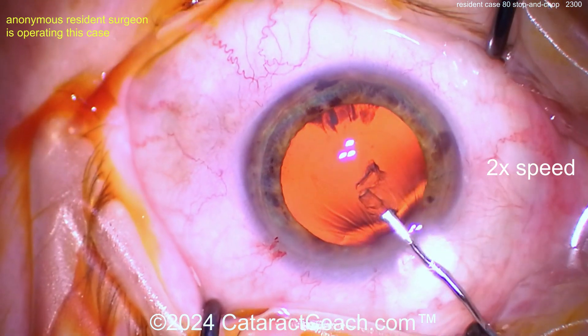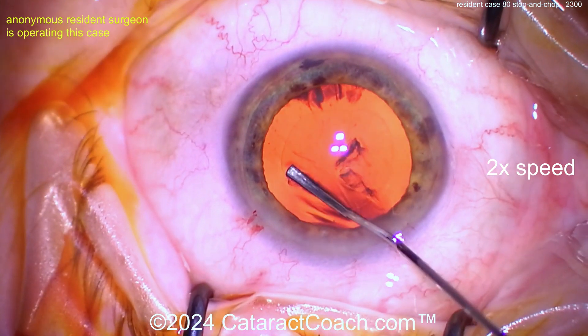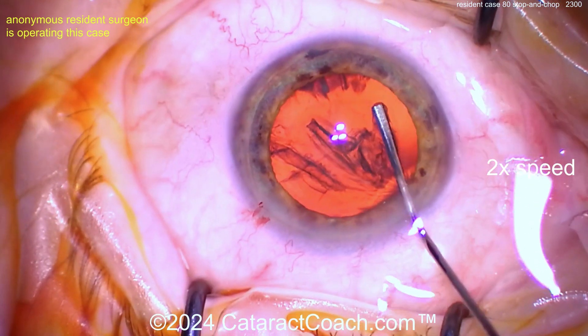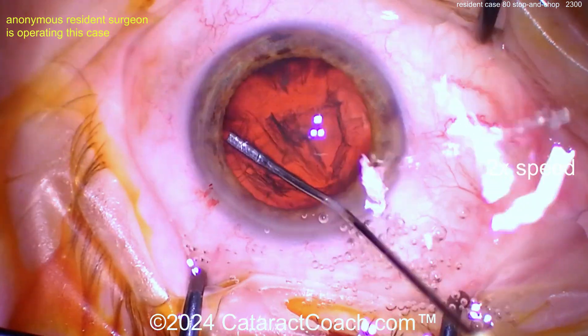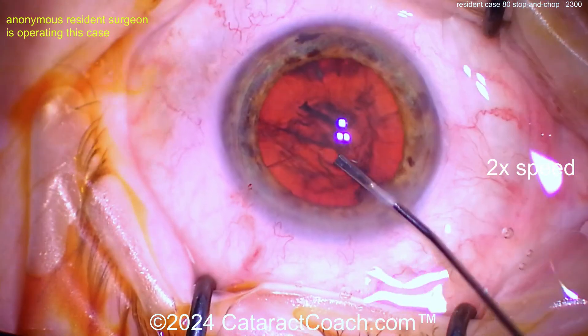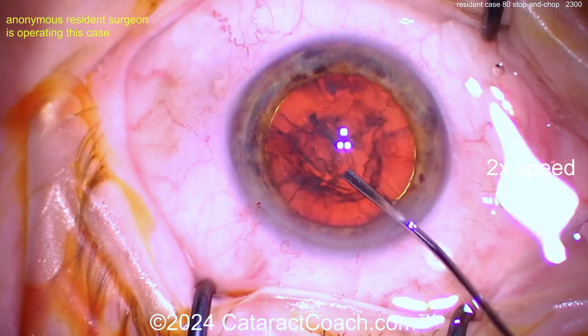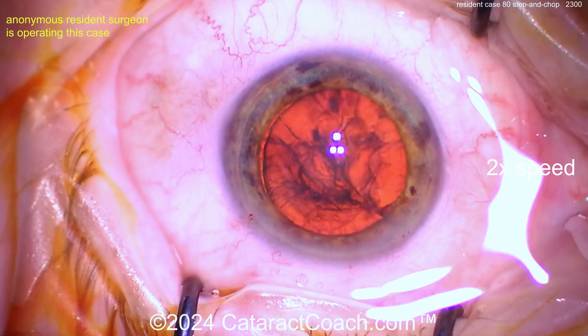Pretty good rhexis — I like it, very nicely done. Now let's do some hydrodissection. Here's the BSS cannula — that flat-tip cannula is neat. Where's our fluid wave? Not yet... try again... there we go. I like the persistence. And can you rotate it? If it does not spin, you will not win — but that looks like you can rotate. Pretty good.